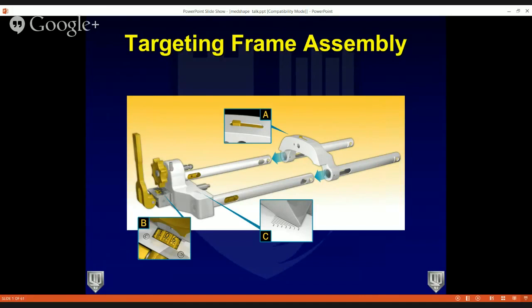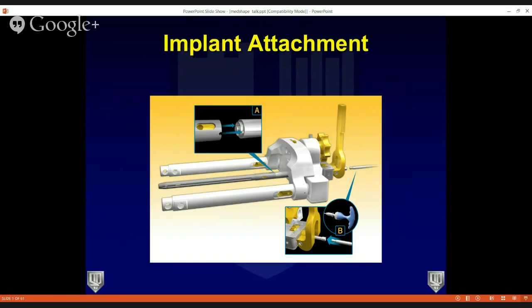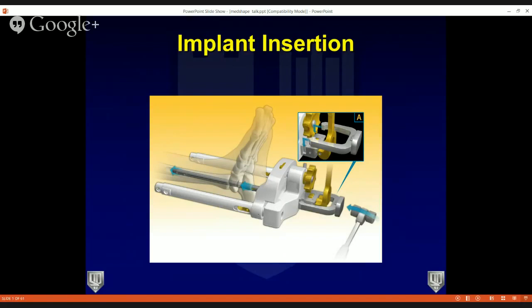Once you get the chatter, you need to assemble the targeting frame. Label A shows the tubes with the reinforcement arch of the targeting frame. In B, you see the dial that allows you to dial in the compression you want from the nitinol component — it starts at zero and you'll typically dial it up to six. Box C shows a gradation scale where you measure and apply your external compression. You'll attach the implant to the frame, then implant the device through the medullary canal as prepared.